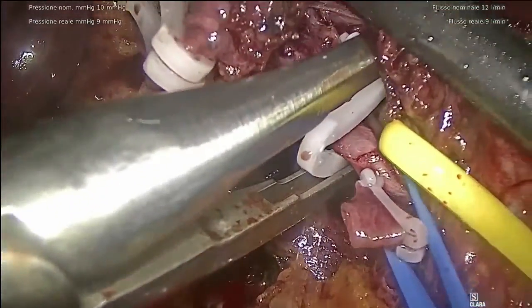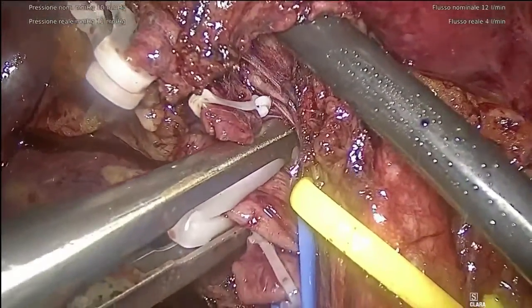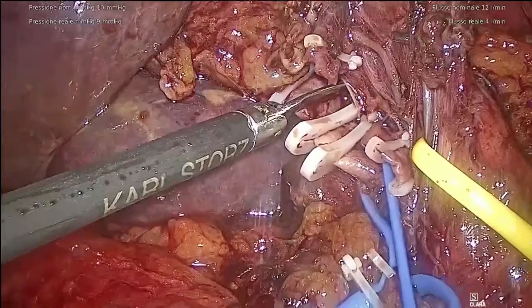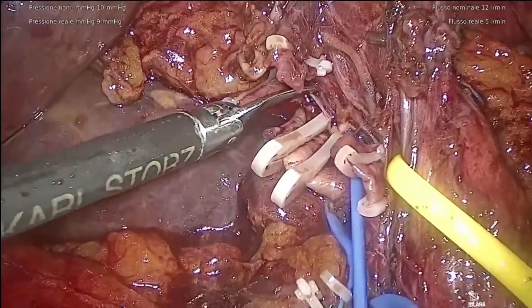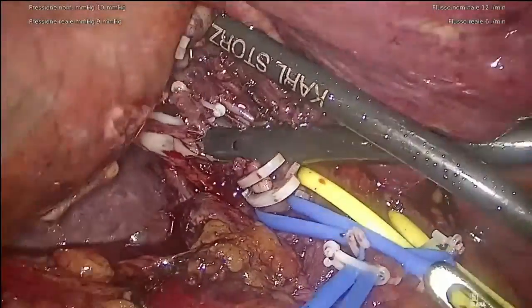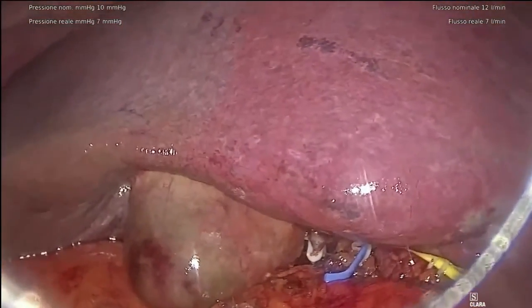Before dividing the right portal vein, we are used to performing an ultrasound check on the left liver in order to evaluate the presence of portal flow on the left liver. After that, the right portal branch has been divided between clips.